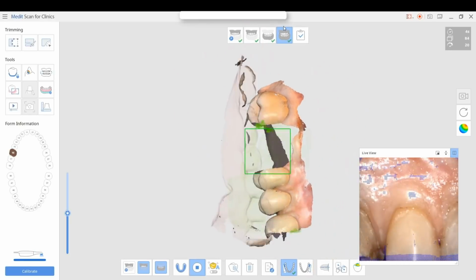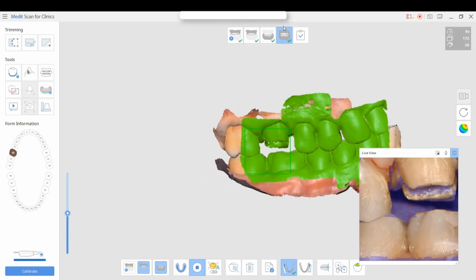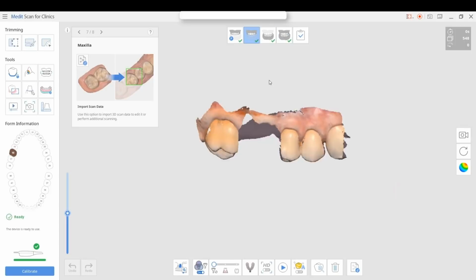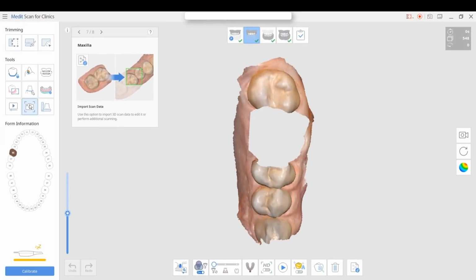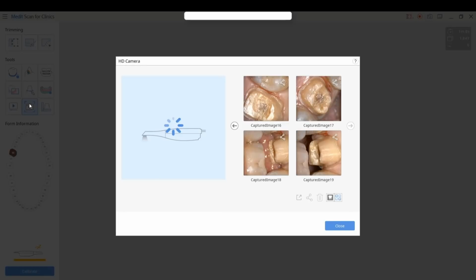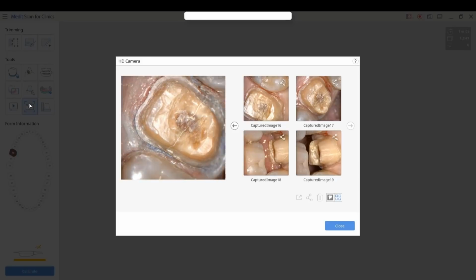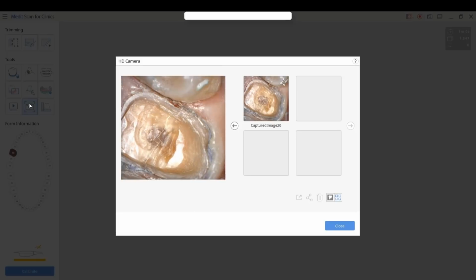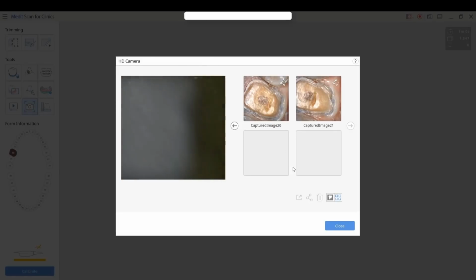I'm going to use the adjacent teeth to mount the upper jaw to the lower jaw before I capture the final preparation. This allows me to save quite a bit of time. We'll go back towards the upper arch, and now I'm ready to image the preparation itself. So we'll displace the tissue with cord. We've got some Expasyl also placed on the tissue to get some hemostasis. Take some photos of the preparation itself, and now we're going to go ahead and image.